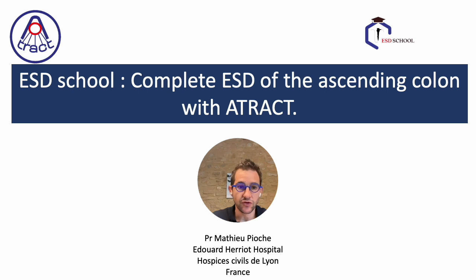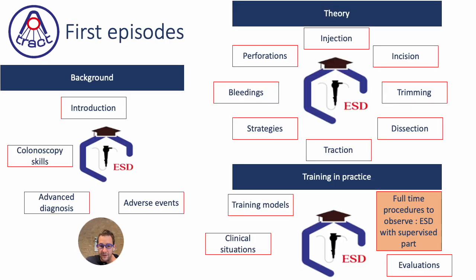This is a new complete ESD case of the ascending colon using traction strategy with the ATRACT device. We will see a relatively simple lesion in the right colon, which is a benign lesion. When the resection seems easy and relatively quick, ESD is a good way to achieve an R0 resection and reduce the number of follow-ups that will be needed.